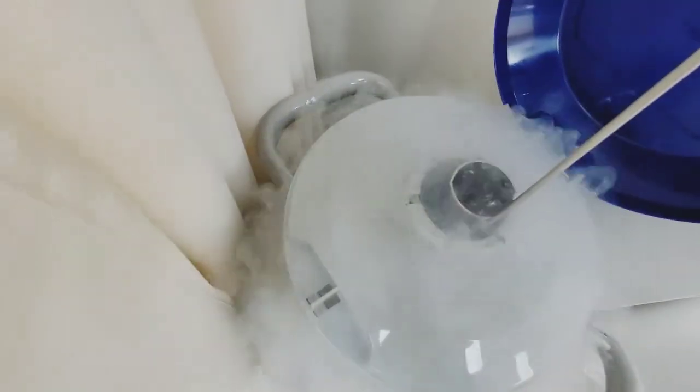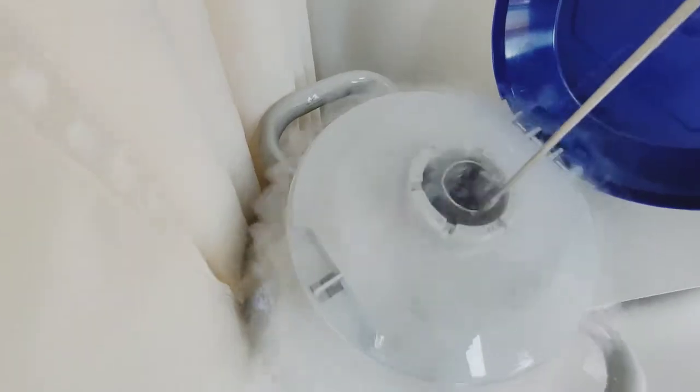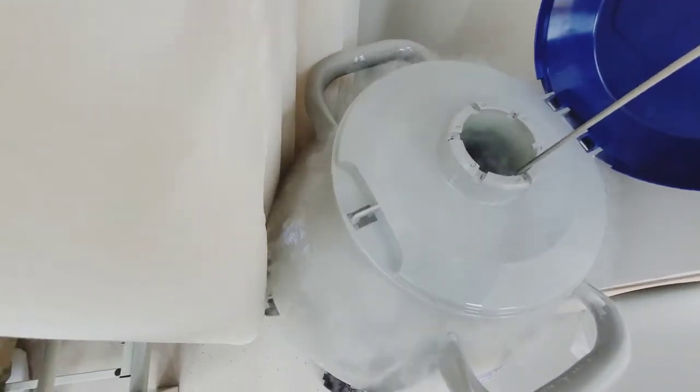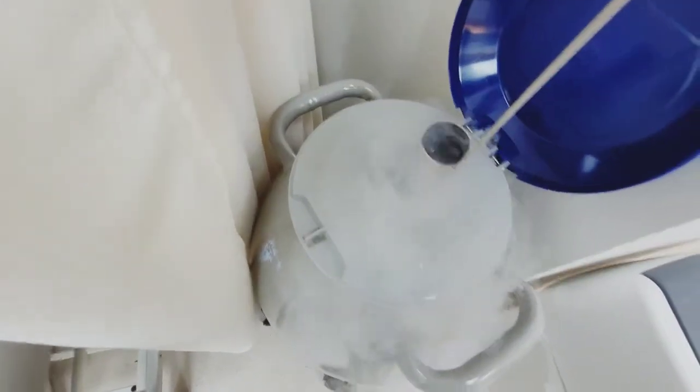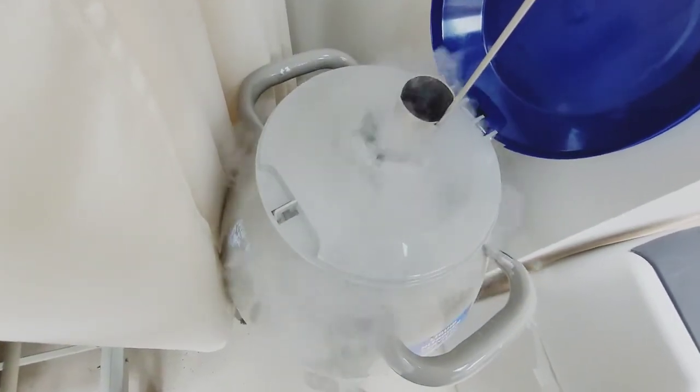See this? See that? That is liquid nitrogen, guys. Magical, isn't it? You can see it. It's smoking. It's actually very cold. It's used to freeze warts. So if you have warts, then we can use liquid nitrogen.